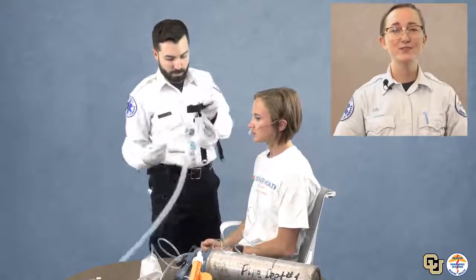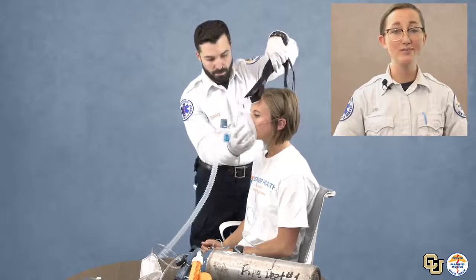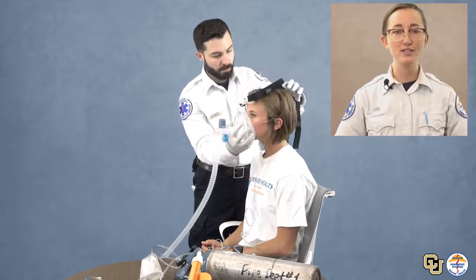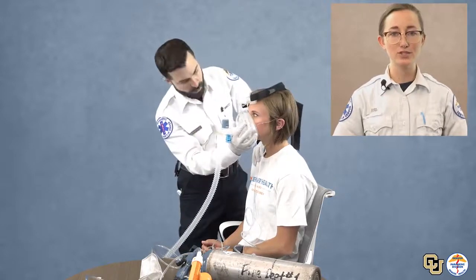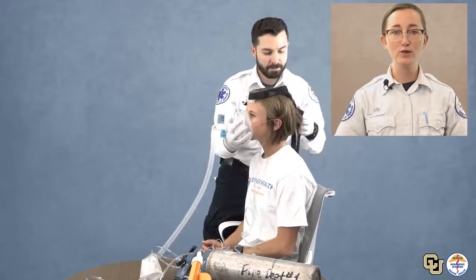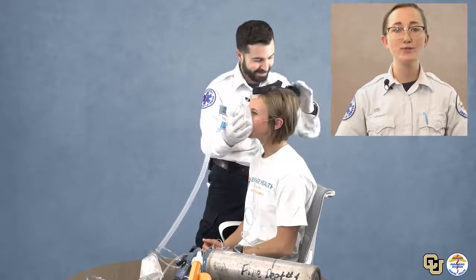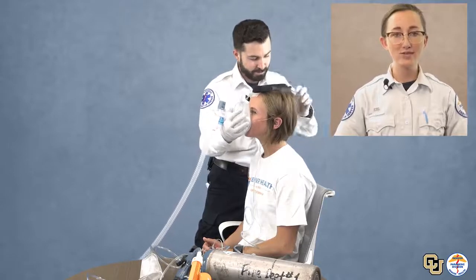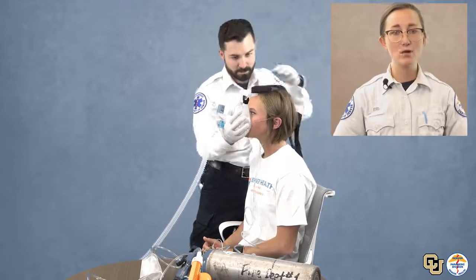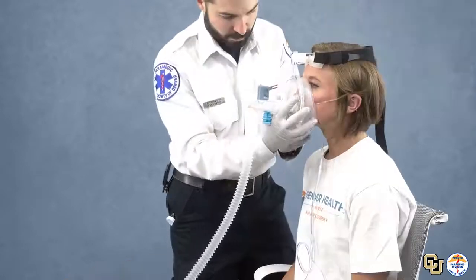The first provider, usually the more advanced provider, will be holding the face mask firmly in place over the patient's nose and mouth. These patients will usually be very anxious, so it is imperative that we calmly explain the procedure as we are performing it. As the patient begins to feel a little more comfortable while feeling the pressure from the mask firmly on their face, we will tighten all the straps around the head. After the straps are tightened, be sure there is very minimal, if any, air leaks around the mask. While monitoring, we should see improvement in less than 5 minutes.